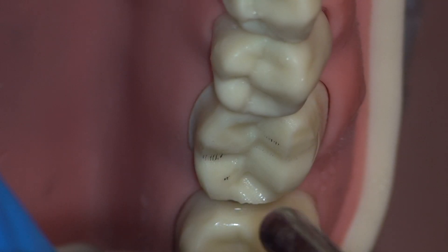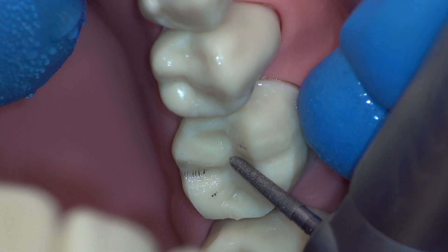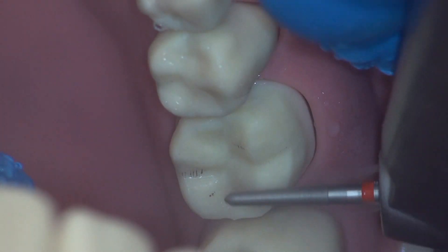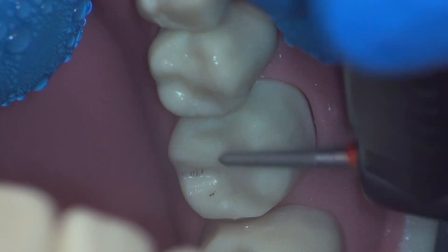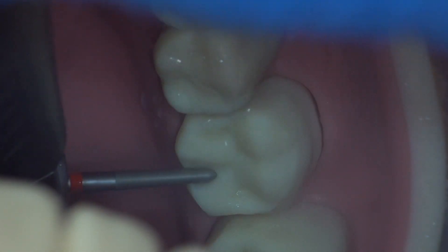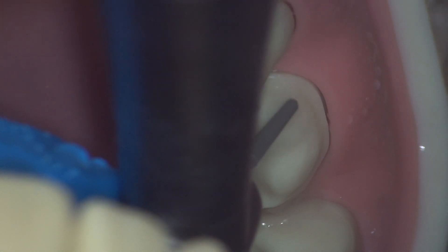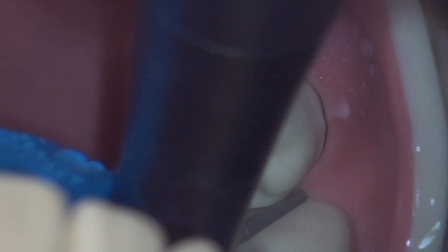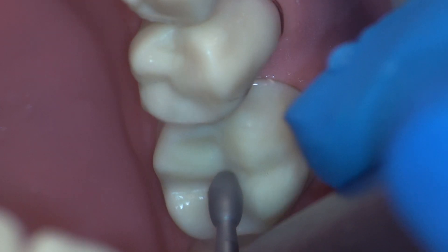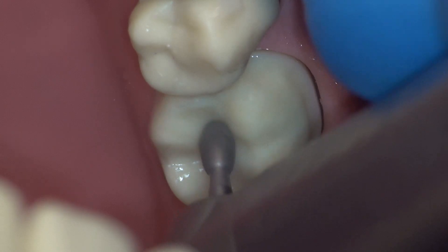We begin smoothing the occlusal surface with a fine chamfer burr. Whenever smoothing, we want the direction of rotation of the burr to be rolling with the direction we're moving. This is the opposite to how we had been using the burr so far. Additionally, while smoothing, the angulation of the burr is changed very slightly with each pass to allow the burr to round that sharp angle. Flipping the handpiece to the lingual side, the direction of rotation will need to be changed again in order to continue rolling with the burr. Here is a good example of changing the angulation of the burr with each pass, which is necessary to round a sharp angle. Switching to a fine football burr, we can round the concave areas of the occlusal surface. Do not use the football burr to smoothen convex or flat areas, as this will result in divots in the prep.